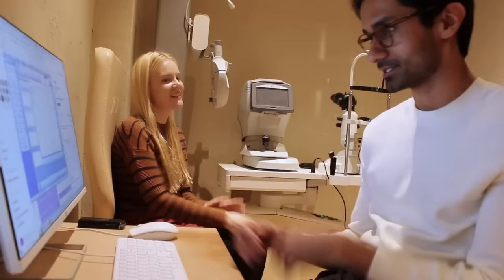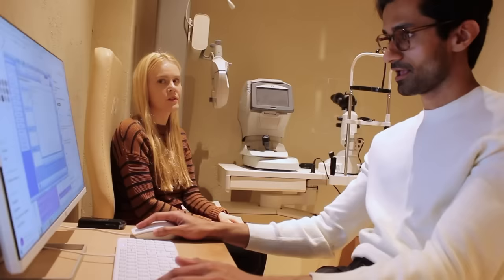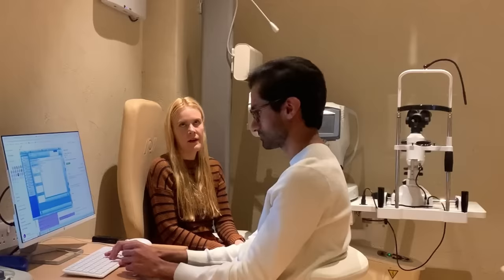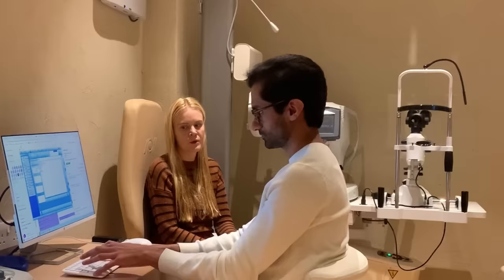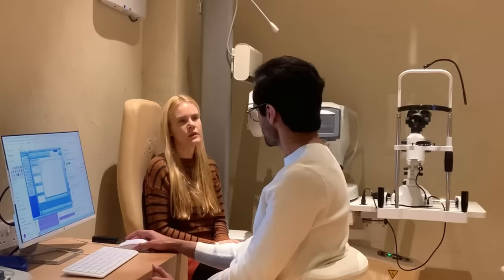So then, any unusual symptoms? Flashing lights, spots? I did have a bit of eye strain today, actually, but I have been looking at the screen quite a lot this morning, doing a lot of work on it. Is that mainly when you notice eye strain? Yeah, that's mainly it, being at work all day doing intense screen work. Okay, and then no black spots or flashing lights in vision? No, I don't usually. Headaches? Unusual ones? Not any unusual ones, no. And double vision? Do you ever notice that? No, not at all.